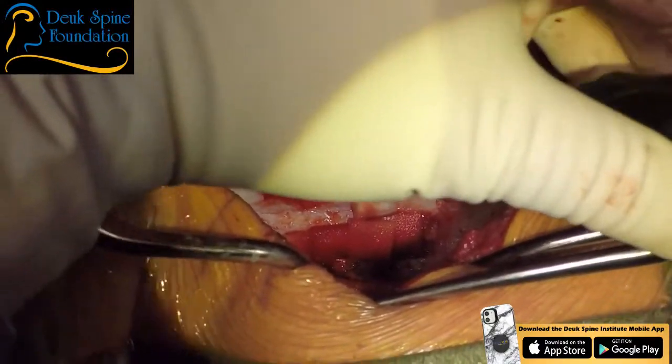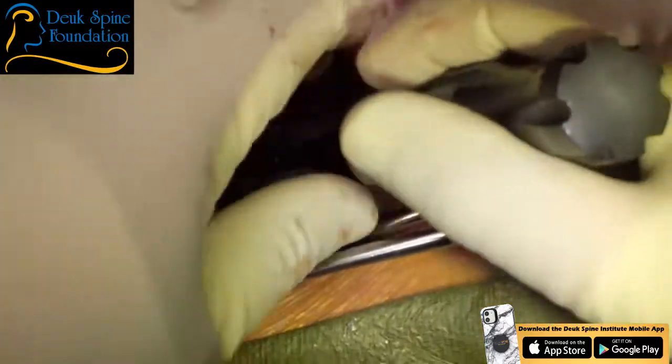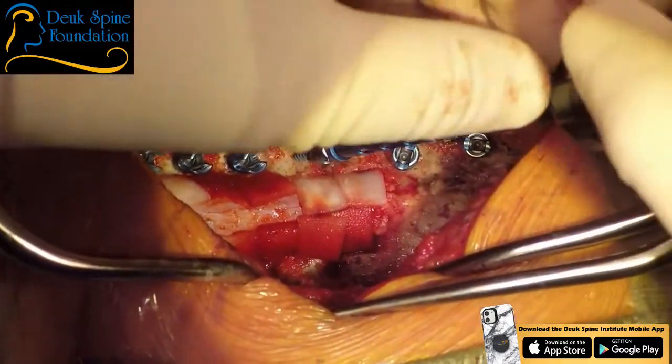You can see the facets moving. And we're going to drill those facets out so we can fuse them. I'm going to go for a fusion on the top of the lateral mass, but also in the facet joints.